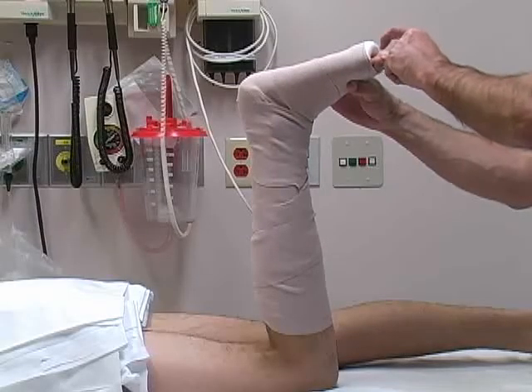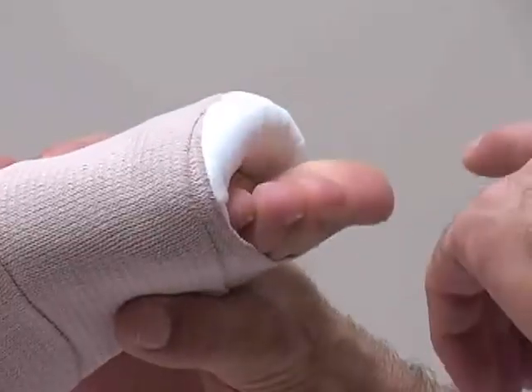Once the splint has been applied, repeat a detailed neurovascular examination of the foot.